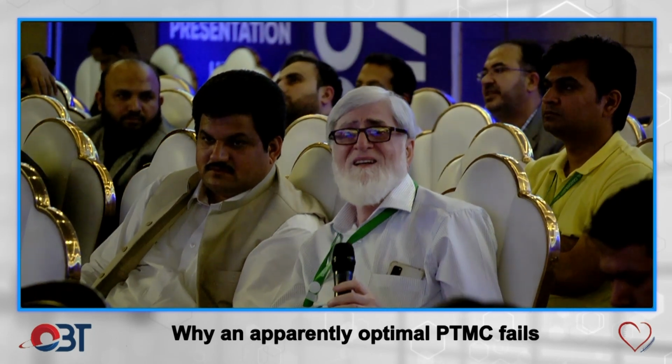Irfan, if you keep the transesophageal probe there, it becomes much easier to know where you are. So there are many ways to do this, but the best thing to do, unfortunately, is to put a transesophageal probe and you will understand. Yes, sir, that's the ideal.